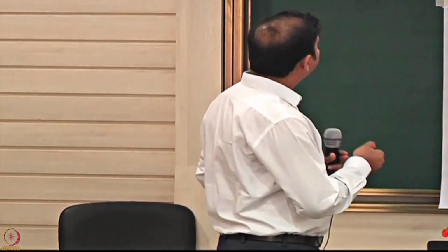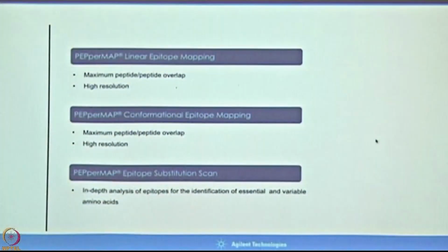So now what's the application of that? This is really important, right? What are you going to do with that? It is used in multiple formats, multiple applications. These slides basically look like different formats. This is 2 by format. They have different formats. They have 16 by format also. It's a normal slide. So various applications mean they have antibody analysis, vaccine development, biomarker discovery, autoimmune, infectious disease, and allergy. So I will cover some of those case studies, right?